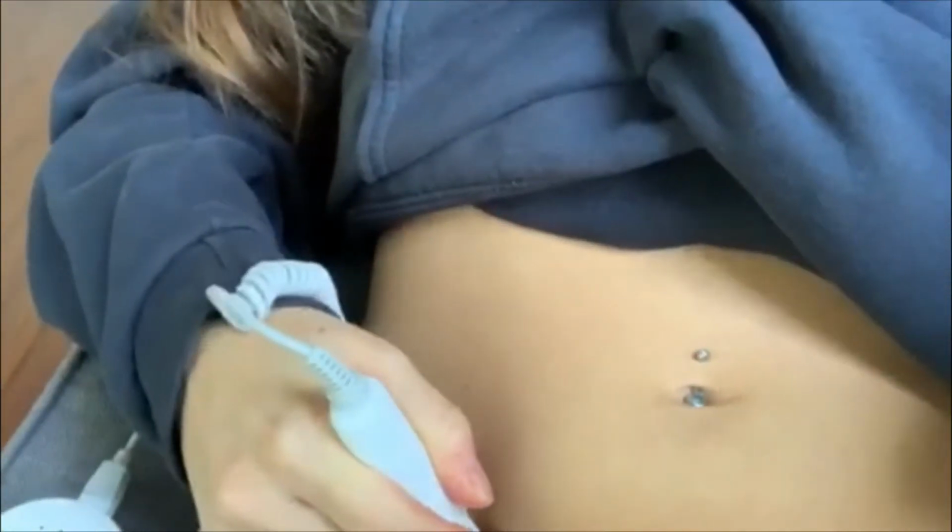All right, so those little numbers, they kind of mean nothing. It doesn't really match. So first I'm gonna find my heartbeat. All right, let me put the volume up because I did find mine. All right, so here's my heartbeat. I hope you can hear it. I found it on the side.